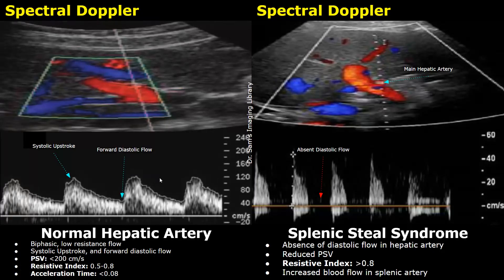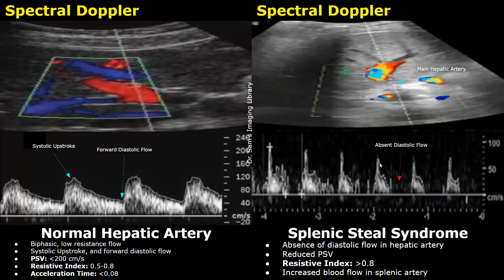There is no diastolic flow seen. Resistive index is measured by the formula: PSV minus EDV (end-diastolic velocity), divided by PSV. Since EDV is zero, the resistive index will be elevated — it will be more than 0.8. Here is a different case of splenic steal syndrome: the PSV is reduced and there is absence of diastolic flow, so the resistive index will be elevated.